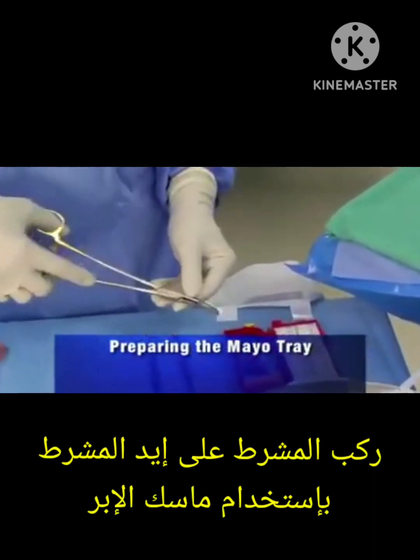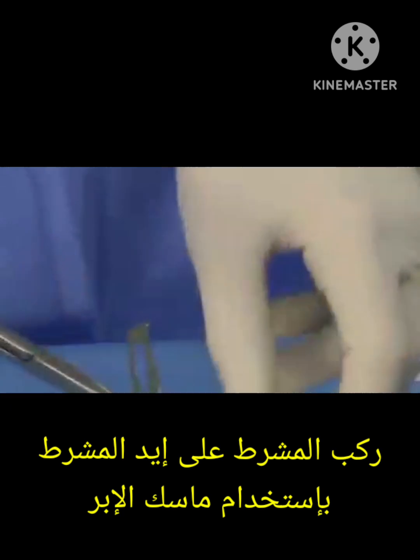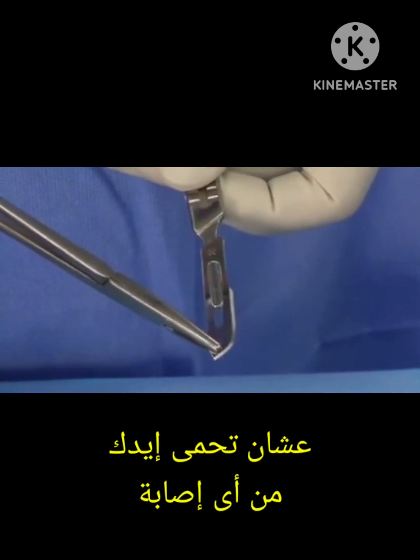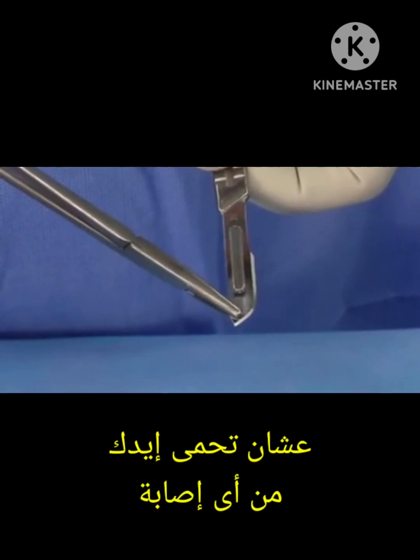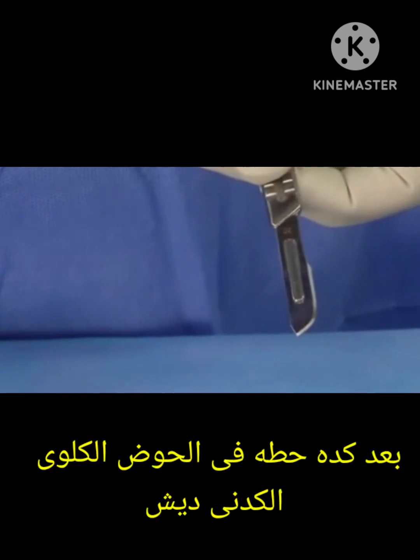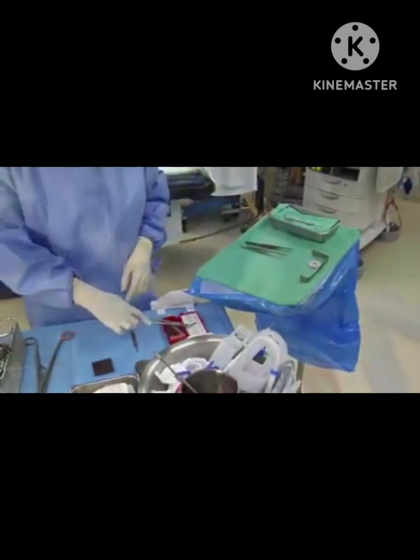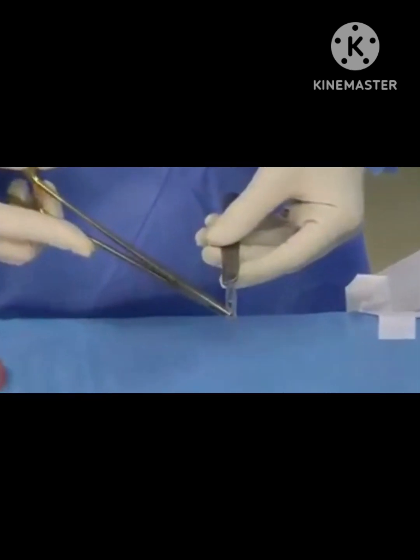Load the scalpel blades onto the handles using a needle driver — this is a critical safety step. Never use your fingers to place blades on scalpel handles, as serious injury may result. Put the loaded scalpel handle into the designated neutral zone container on the mayo tray. Place any other loaded scalpels in the needle counter box for protection.